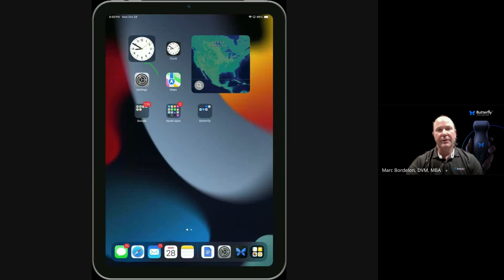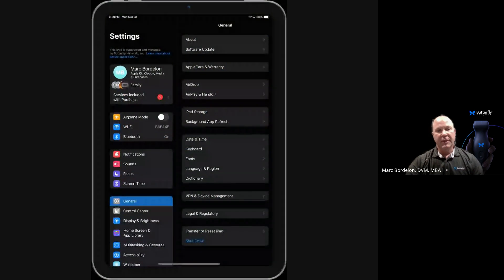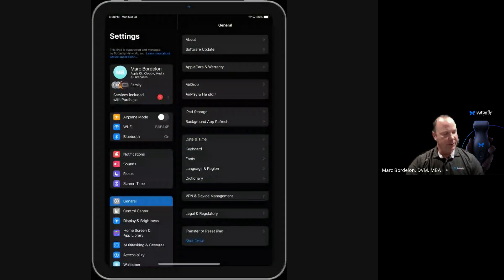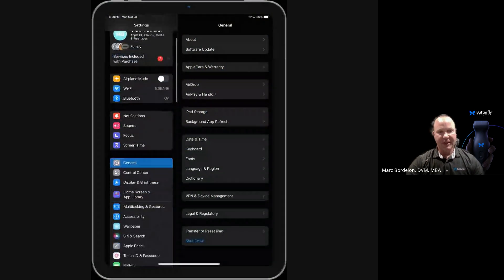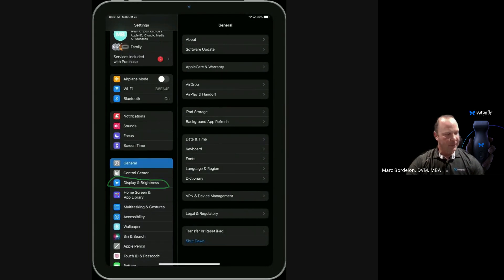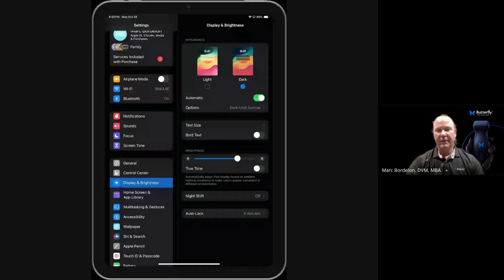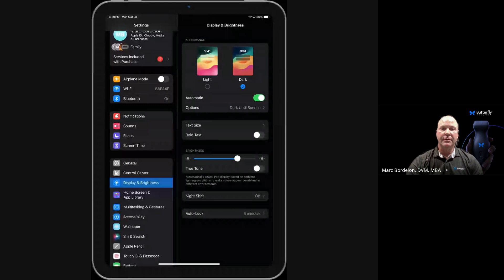The first step that we're going to do is go into our settings. When that tab is pulled up, on the left-hand side, we'll find an area called display and brightness. I'm going to go ahead and click on that, and there's really just two settings that we need to adjust.